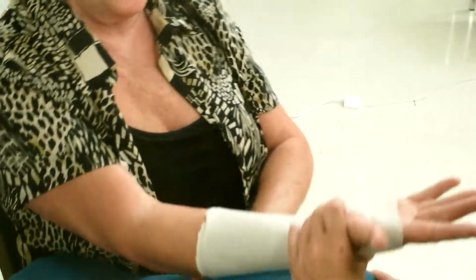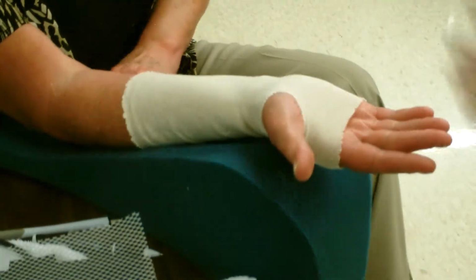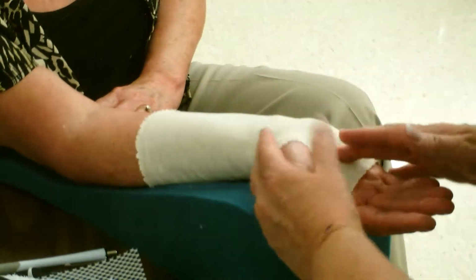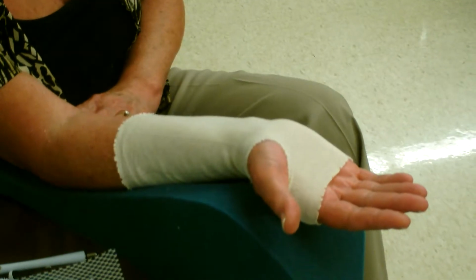All right, and I would like to splint the patient this way. I kind of like say, get yourself comfortable where you're in a good place, okay? And I want them, let gravity do the work for you. She's going to be in a little bit of extension naturally, okay? Now, typically, in the lab, we'll have little, we call them China markers or wax pencils.